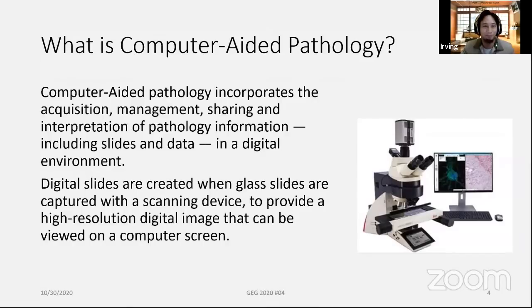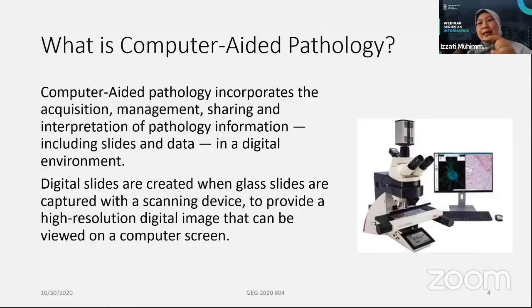I will repeat my explanation. So this work is related to the job that pathologists do. They usually do the glass slide reading of the biological substance. We may have that experience from junior high, when our biology teacher asked us to see the slide under microscope observation. So the tools arrangement may be like this.